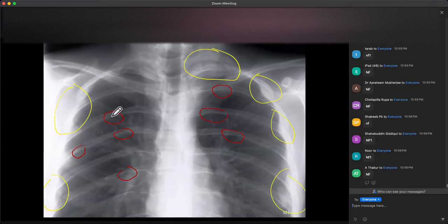But you see the consequence of that neurofibroma expressed as scalloping or erosion of the inferior rib. Don't forget, the rib has got the vein, the artery, and the nerve underneath it. And so the vein, the artery, and the nerve, any one of those three could be responsible for the rib notching. It's almost always due to coarctation, and that's what everyone says. But do look at the periphery of the film and make sure that you're not dealing with schwannomas or neurofibromata. Yeah, and that was the case in this patient.